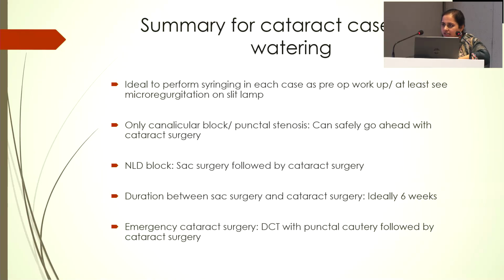Emergency cataract surgery where some phacolytic or phacomorphic glaucoma is there, DCT with punctal cautery can be done, but again that 3 weeks interval is still there, so be cautious about the use of antibiotics.